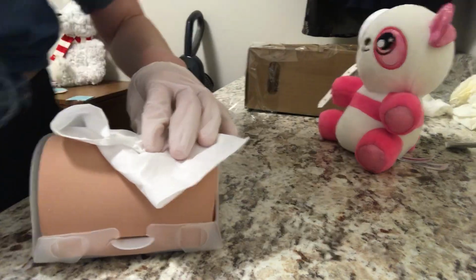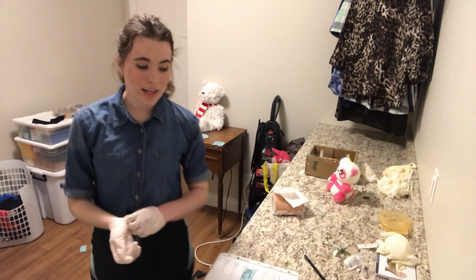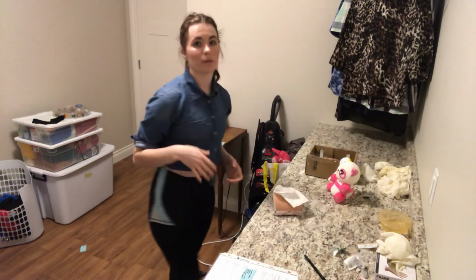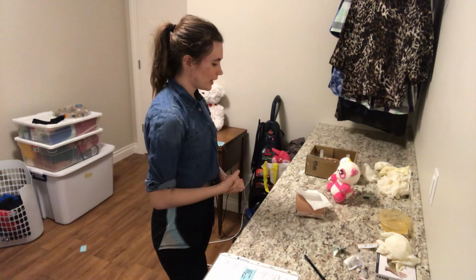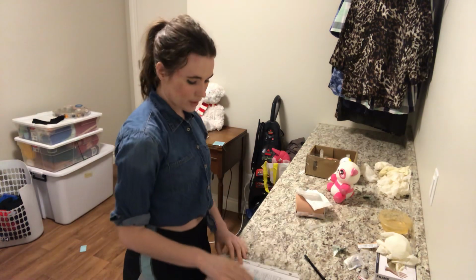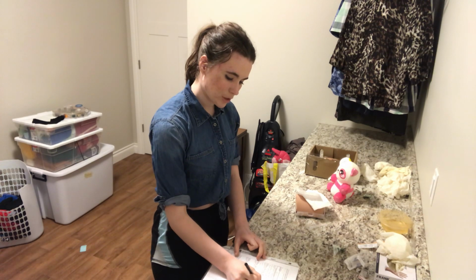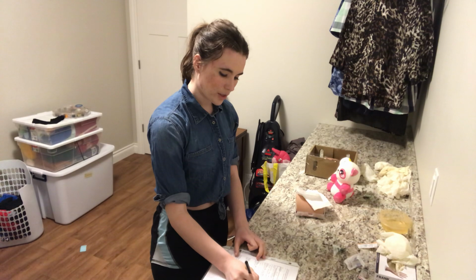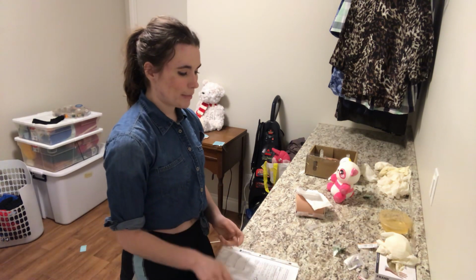And so now I'm going to lift you. Please don't fall. Okay. So now that I've administered that, I'm going to take off my gloves. And I'm going to perform hand hygiene. And I'm going to make sure that my patient is doing okay and they verbalize that they are doing all right. So I'm going to sign on the MAR that I've given the medications. So my name, student nurse, because that's my designation. Then also the time. It's only 1:00 right now. And so now that we've documented that, I'm going to talk with my patient a little bit longer.